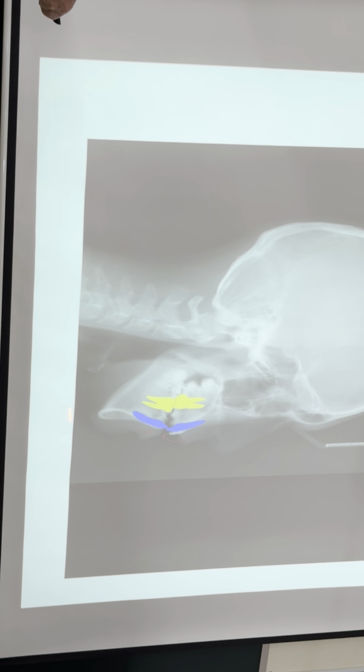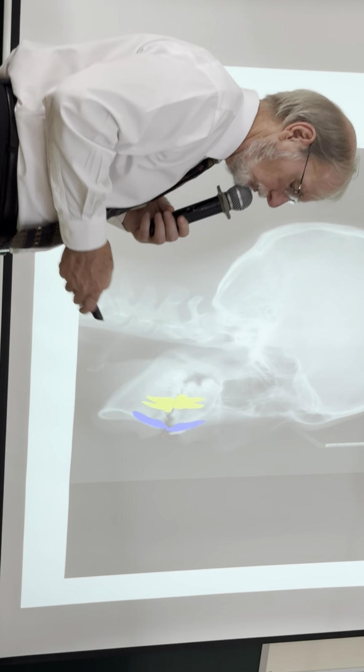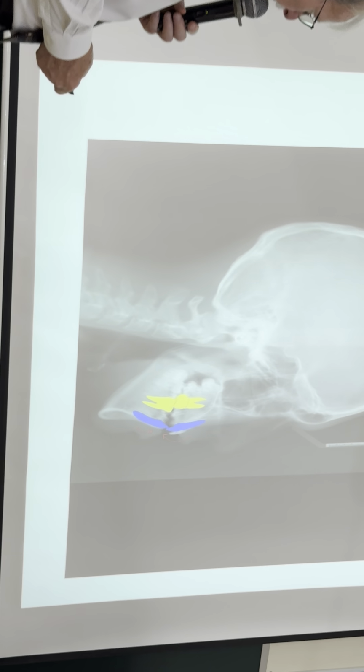And now with the new aligners, you can also expect maybe 1 millimeter of intrusion here. So you drive this tooth up and back with an attachment, push it, push it, push it. You push this one up, and you push this one down, so you rotate your occlusal plane. That's the whole idea. If you can rotate your occlusal plane, you will get good resolution of your open bite, but we'll see that another time.